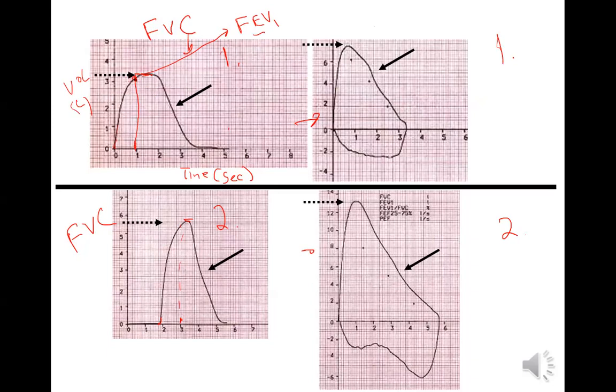Okay, so that's what it's in the first second. So let's say, what did we say the FVC was there, 3.4? Yeah, the top one, patient 1. So if the FEV1 is 3, you can get a ratio now. So the FEV1, forced exhalation in 1 second of FVC, divided by your FVC. So you'll divide the 3 by your 3.4, and that should be above 80%. 80% is the golden number so far. Okay. So that's called the FEV1 FVC ratio.